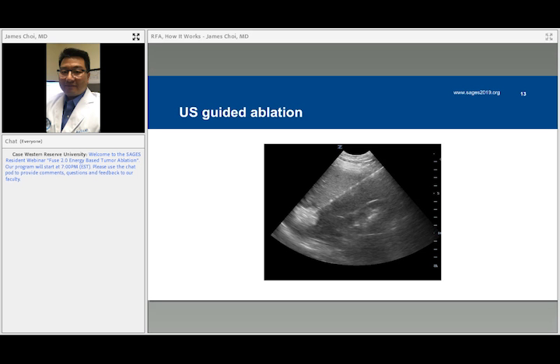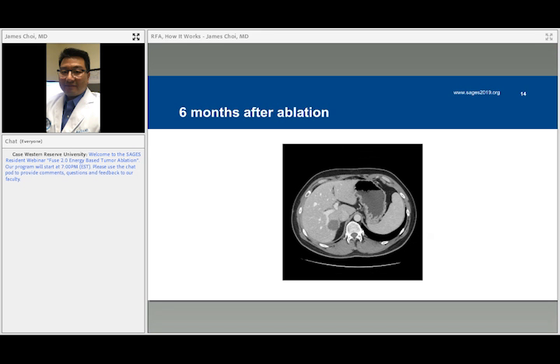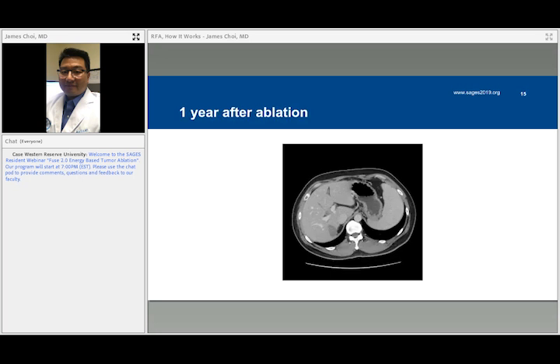And so the patient underwent successful percutaneous ablation, and this is 6 months after ablation. You can see a nice clear ablation zone without obvious evidence of a recurrence. And this is 1 year after ablation, and you can see that the ablation zone is actually a little bit smaller now, and it's beginning to scar, and without evidence of tumor recurrence.